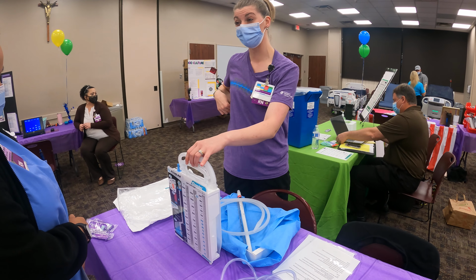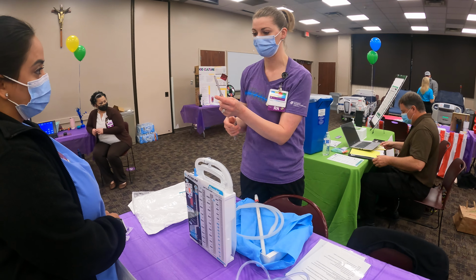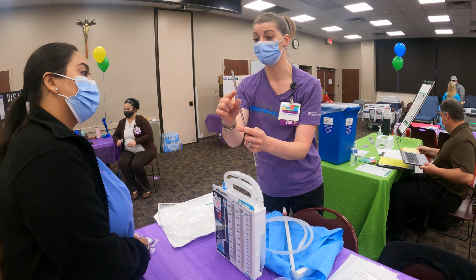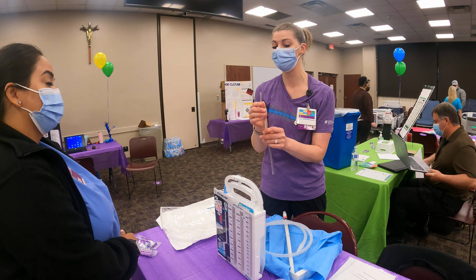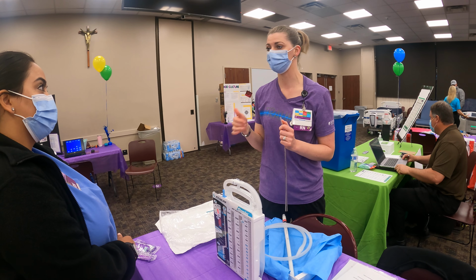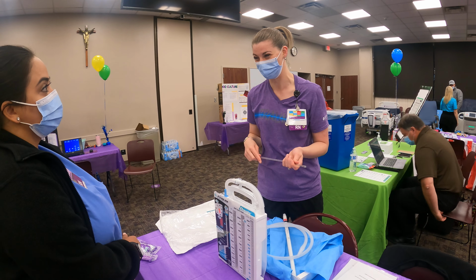So you want to always start at your patient, okay? This is what is inside your patient. So there's a couple of holes here. Some other chest tubes have more holes. If you can see one of these eyelets sticking out of your patient, that's where your leak is, and you're pretty close to dislodging your tube. So you want to try to secure it as much as possible and call us and say, hey, my chest tube's about to fall out.